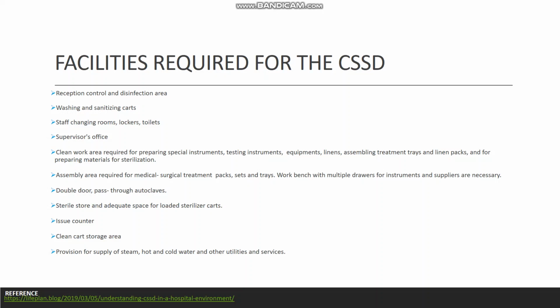Double door pass-through autoclaves, sterile store and adequate space for loaded sterilizer carts, issue counter, clean cart storage area, provision for supply of steam, hot and cold water and other utilities and services.